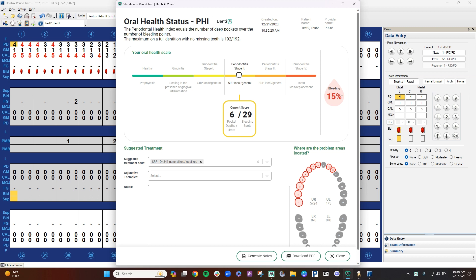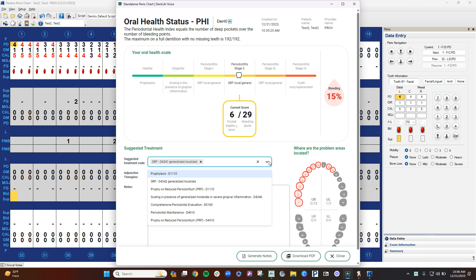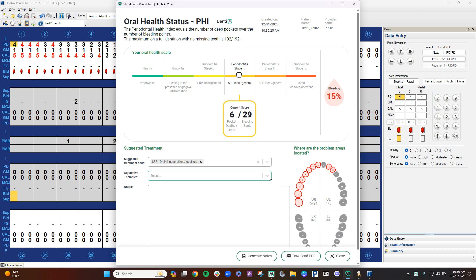Based on what it finds on the perio chart, it will give you a suggested treatment code based on the stage. Again, as a clinician, you can still go down here and adjust it if needed. It will also give you adjunctive therapies.